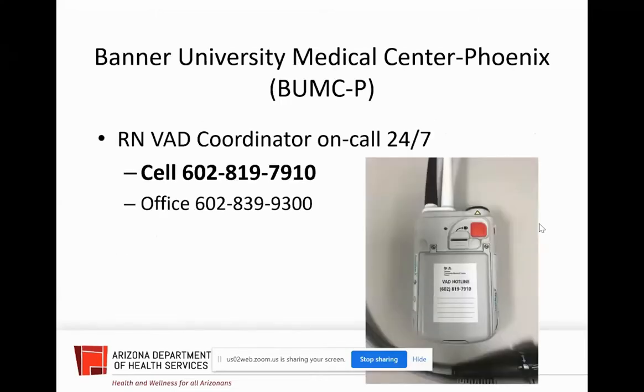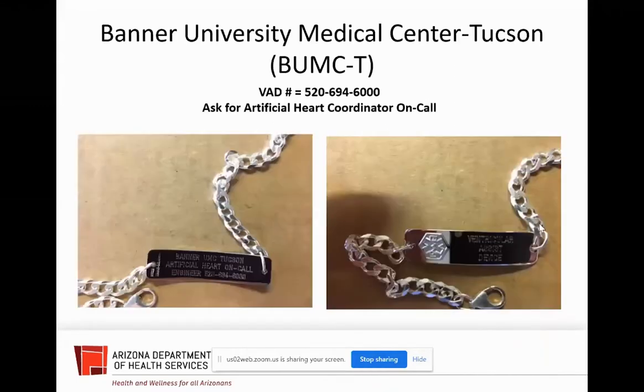BUMCP, our hospital, has a program. As many of you know, we have about 45 patients on support in the community, including 3 artificial hearts. We have an RN VAD coordinator on call 24 hours a day. You can program into your cell phone our emergency line of 602-819-7910. The picture on this slide shows that the back of all of the controllers that the patients have for their equipment has our emergency contact on it as well. This number rings right to a person. There's no automated system to go through or operator. And we are all trained in emergencies.